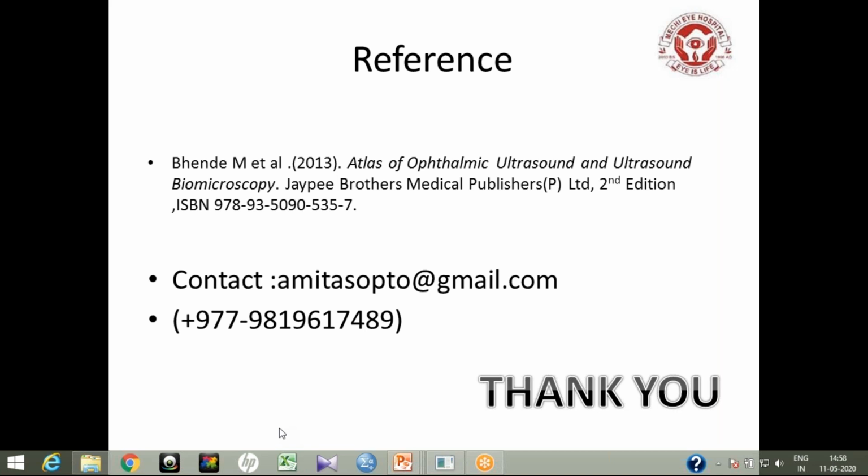Actually, when we do a B-scan, we are not that static. Our hands move, so it's very difficult to comment on whether the vascularity is moving or not. So, as Amit rightly said, this echo-based Doppler technique is the best suited. But still, in some books we find that by doing this static B-scan, we can find whether there is vascularity or not, especially in choroidal melanoma. I think they have written it in books.